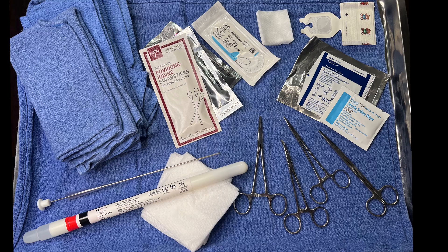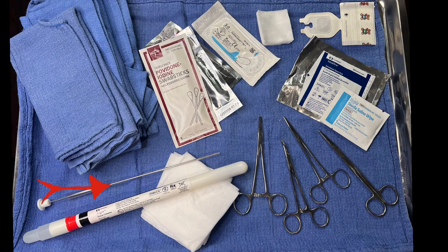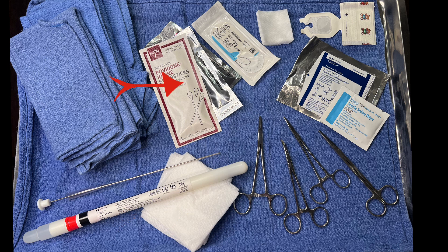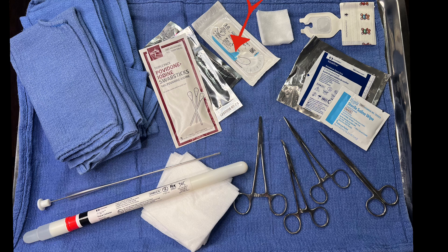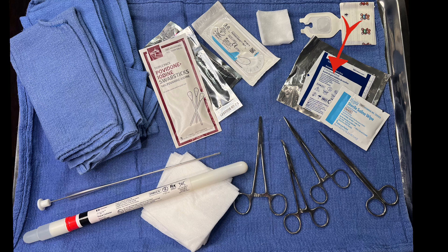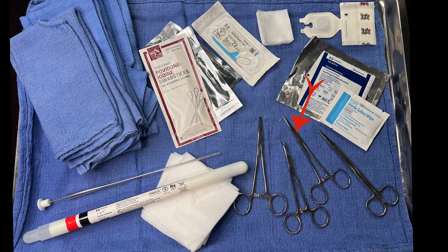Therefore, you will need gloves, hat, mask, and gown. You will also need to decide on an 8 or 10 French Argyle Trocar catheter. In addition to your chest tube, you will need sterile towels and 4x4 gauze, as well as hospital-approved cleaner, such as Betadine or Chloroprep. A 3-0 curved silk suture, you'll need 2x2s, a Tegaderm, Vaseline gauze, normal saline wipes, as well as straight hemostats, curved hemostats, needle drivers, and scissors.